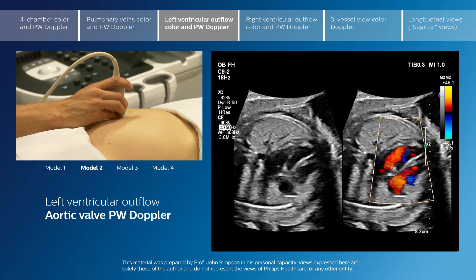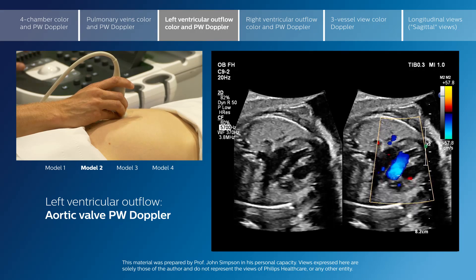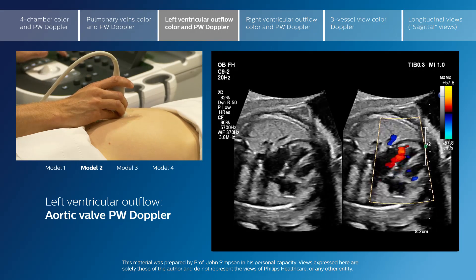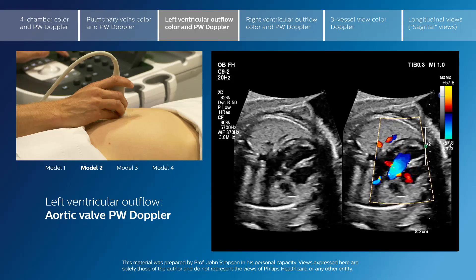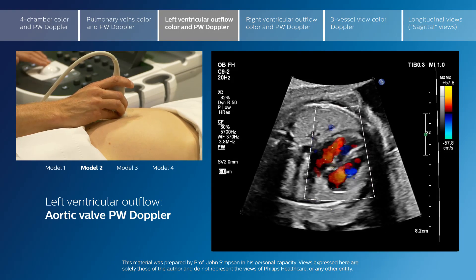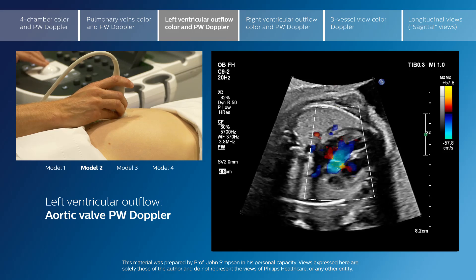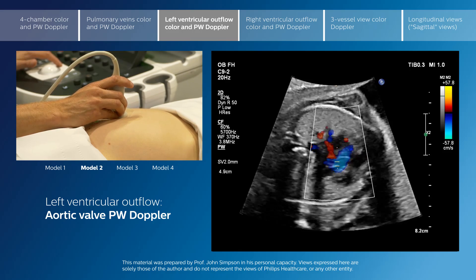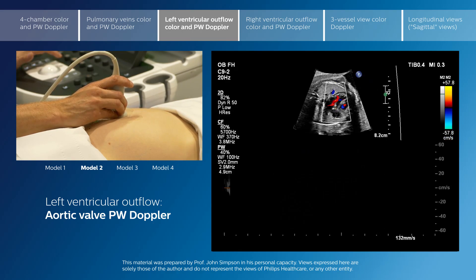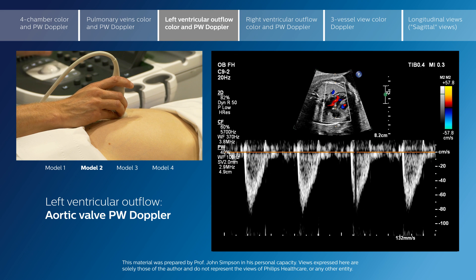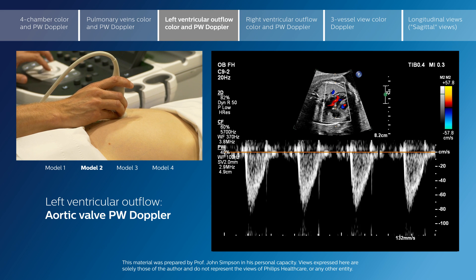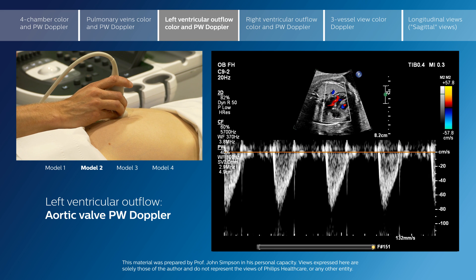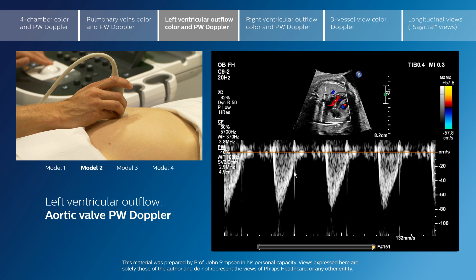This is a good angle to Doppler the aortic flow. We move the aortic cursor just beyond the aortic valve, as seen here, and then we see a nice clean trace of the aortic valve. To obtain a perfect trace, we want a clean Doppler signal and a closure click of the aortic valve, confirming that we are at the level of the valve.